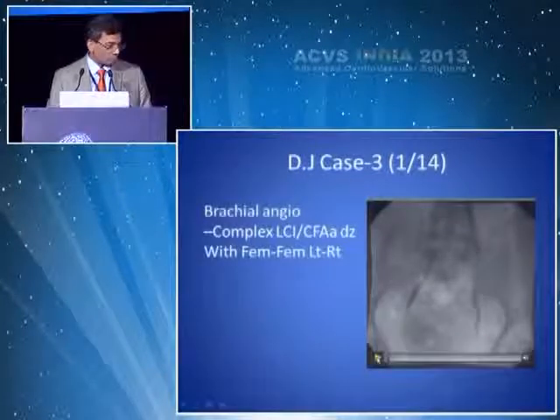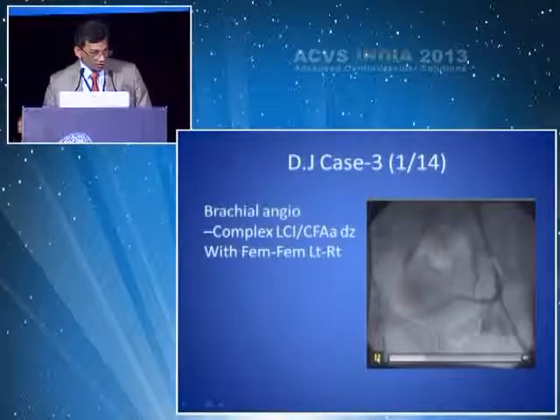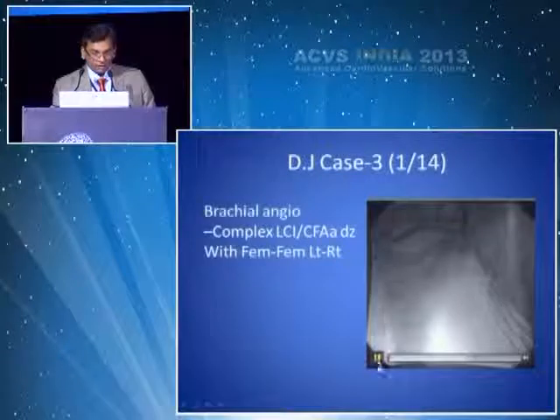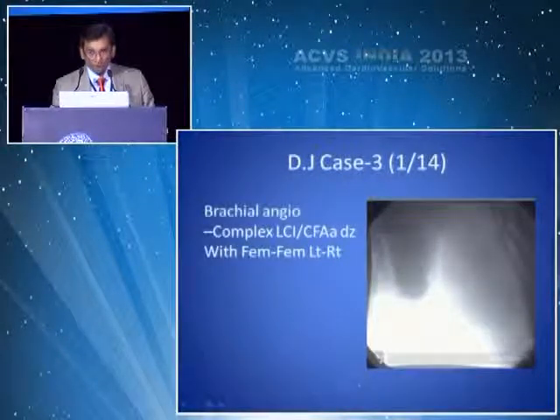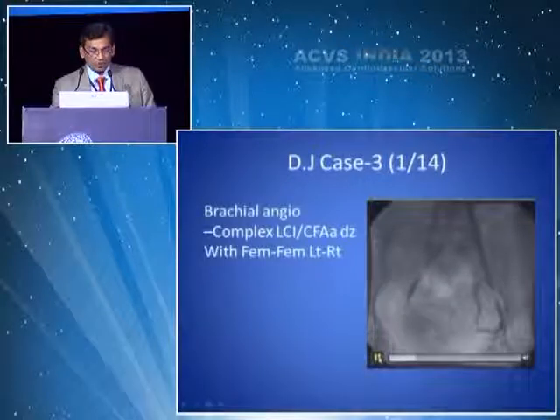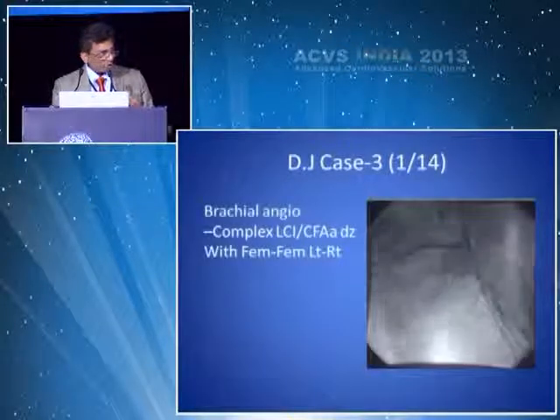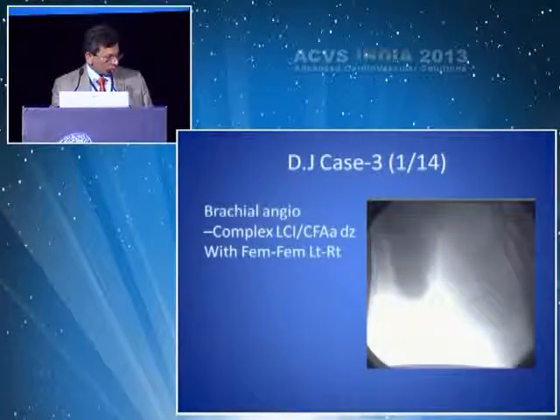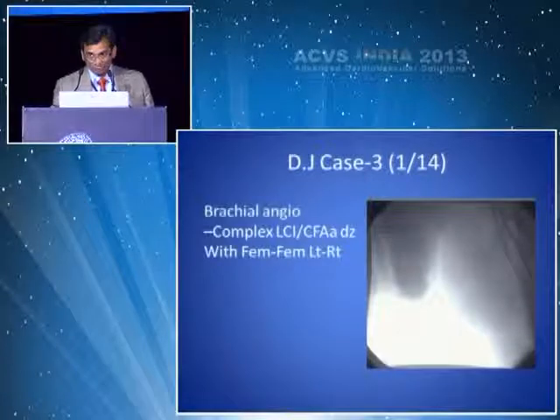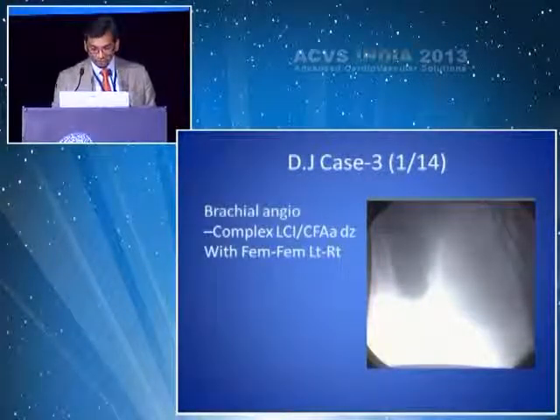Because he has occluded iliac vessels, he had no access from the groin, and also the ischemic foot that he presented with was the left, and he has a fem-fem graft, which would be very difficult to go up and around. So we went brachial access to this patient and did an angiogram. As you can see, it's complex. Next.